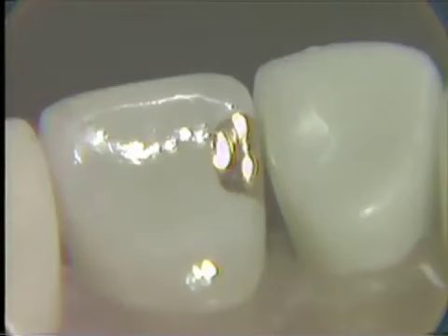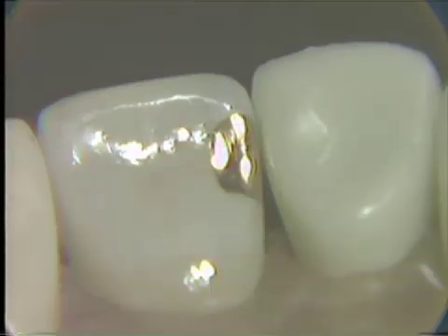The rubber dam has now been removed, and the check has been made for the occlusal contact in this area, and there is no interference present. As we look at the labial of this final Class 3 cohesive gold restoration, we see that indeed it is a labial margin that is rather inconspicuous and is therefore harmonious as far as its aesthetic value is concerned.